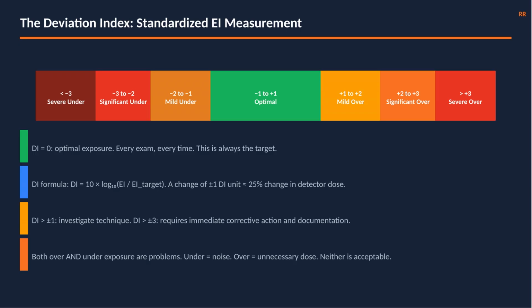Both directions are problems. DI negative, below target: quantum noise degrades the image. DI positive, above target: patient received unnecessary dose. Neither is acceptable under ALARA.